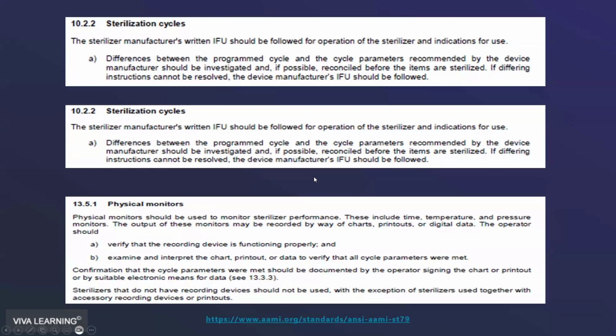And one of the common mistakes, I think, that people make with sterilizers is buying what is called an immediate use sterilizer. Best known of these is a Statim sterilizer. A Statim sterilizer used to be called a flash sterilizer, and that terminology has changed over the years to immediate use because it's more descriptive of what it was designed for.